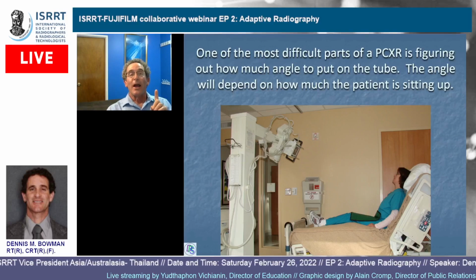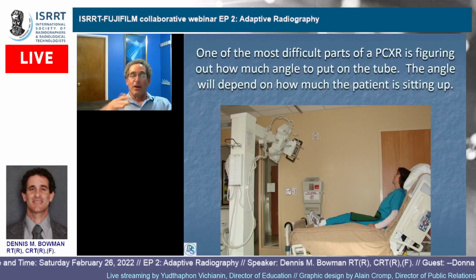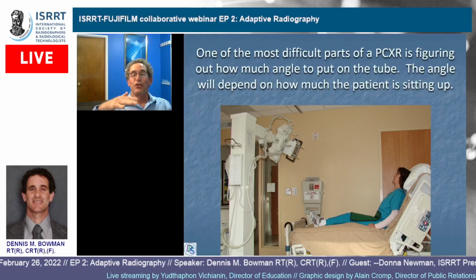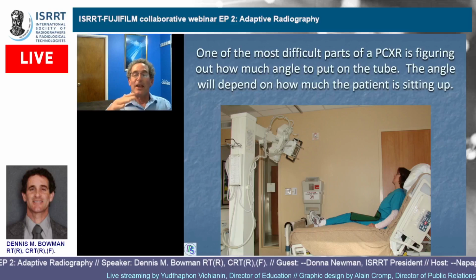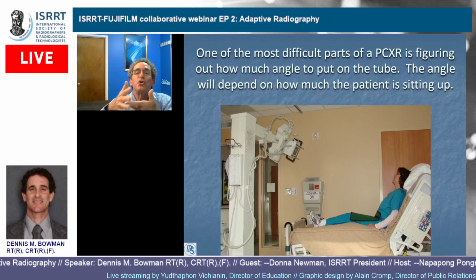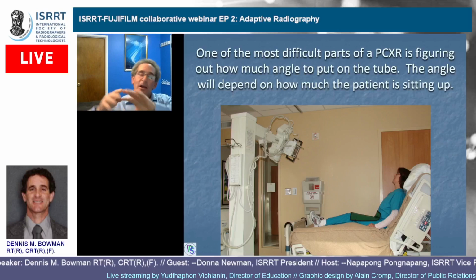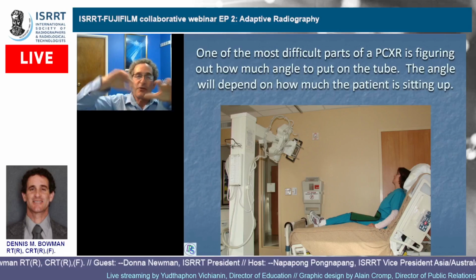Which is why, when you're doing an abdomen series, and our abdomen series is an AP or PA chest, a supine abdomen, and an upright abdomen. If they can't do a PA chest, then you're going to do an AP chest. And if they can't do an upright abdomen, then you're going to do a decube abdomen. When you get into doing a decube abdomen, how well are you really seeing the diaphragm and free air and all that?